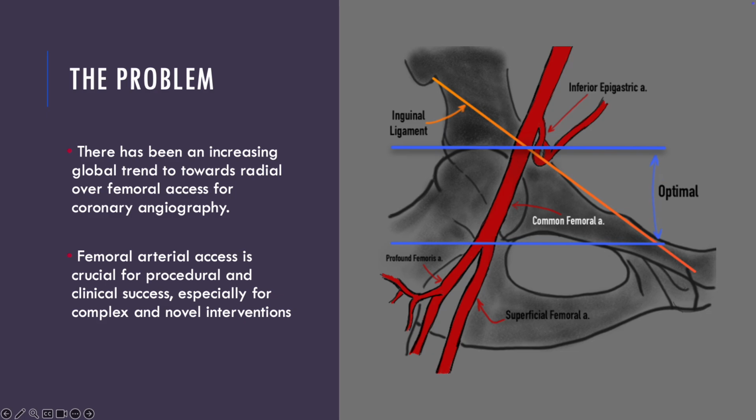However, the femoral artery cannot be avoided, and with changing technologies in cardiac interventions and cath labs, ORs, and CSICUs, there is a renewed need for safe large bore femoral access. New trainees will conventionally not be as exposed to femoral access and are at risk of increased rates of complications. Paradoxically, senior operators will be less familiar with aspects of modern-day femoral access, such as ultrasonography.